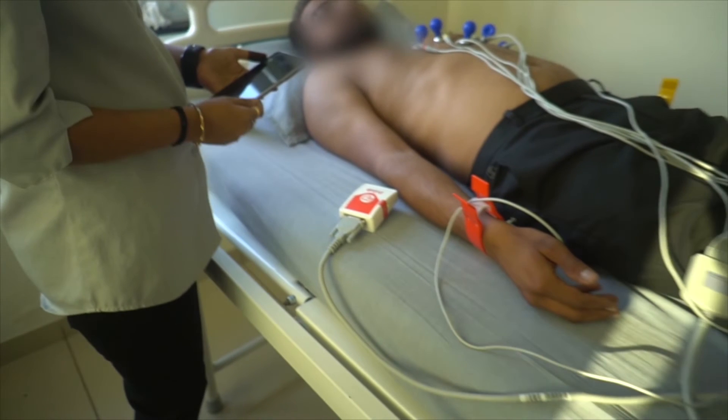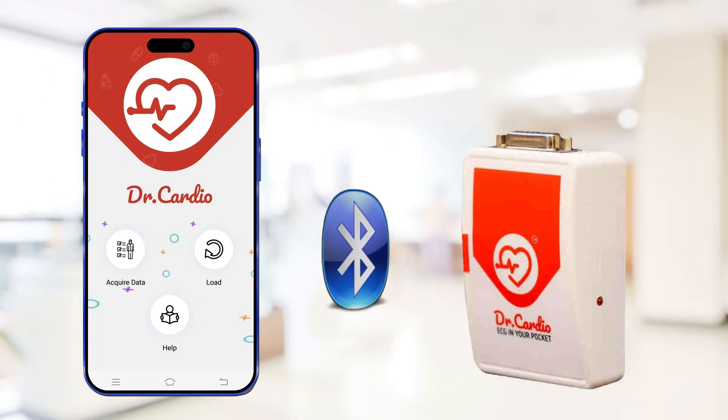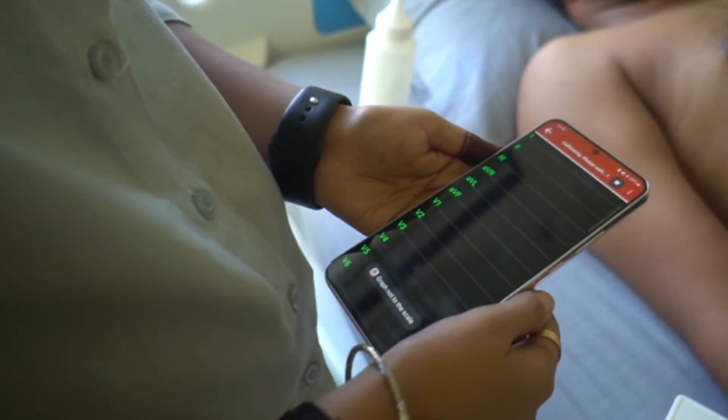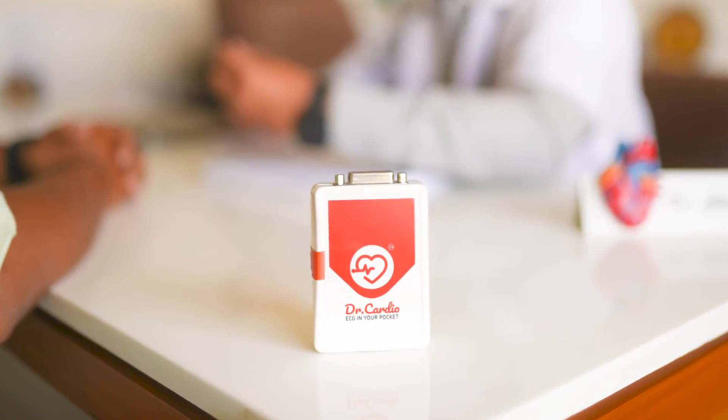To use Dr.Cardio, simply download the app from the Play Store, connect it to the device via Bluetooth, place the electrodes on the chest, and the report will be generated quickly. Dr.Cardio is a ground-breaking medical innovation in the world of technology.